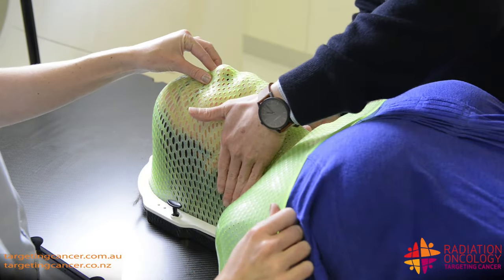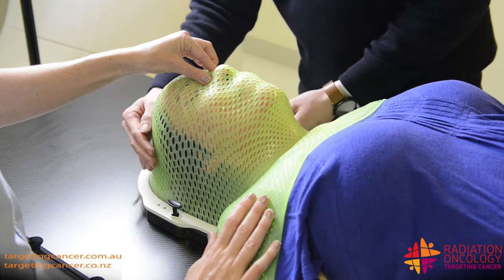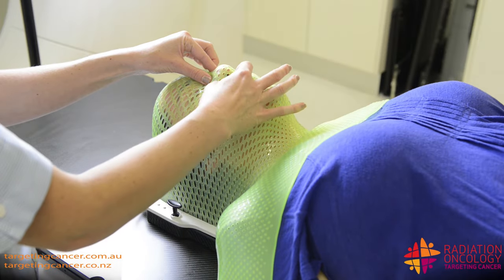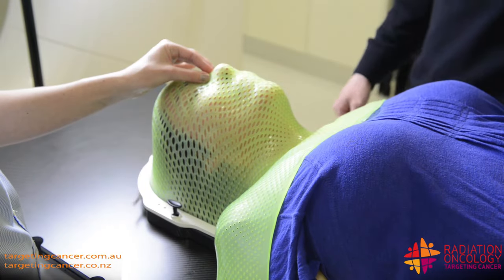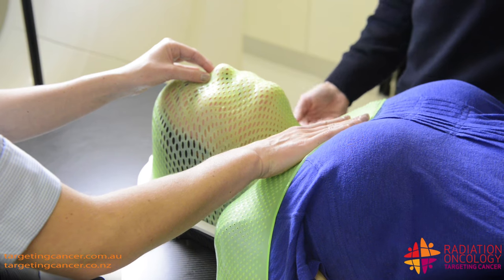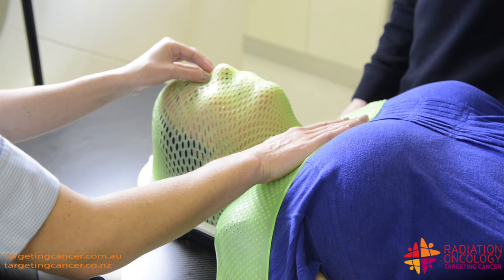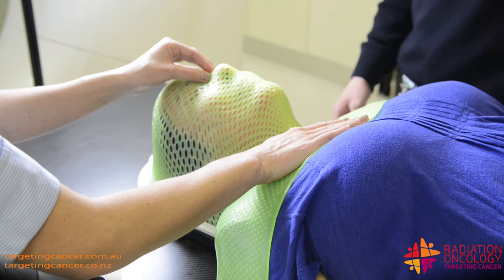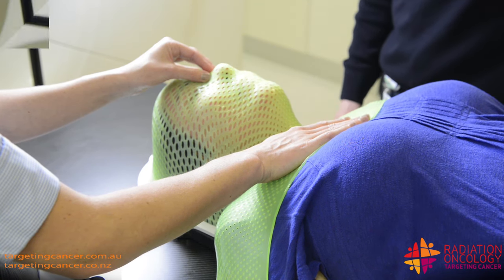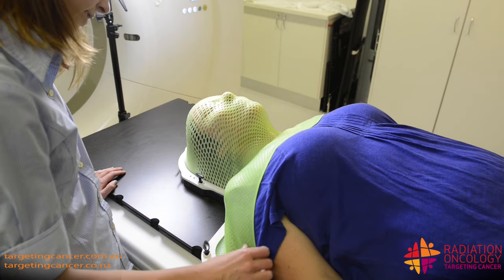So the idea behind this is it's going to contour to your features. And when it hardens, it pretty much eliminates any sort of movement at all throughout the process. So when you come in for treatment, you'll probably notice that it will have hardened a little bit more outside, and it will be quite a bit more firm when you're on the treatment unit. Firm is good though — it eliminates any movement at all. Doing really well there, Julie. Just waiting for it to harden now.